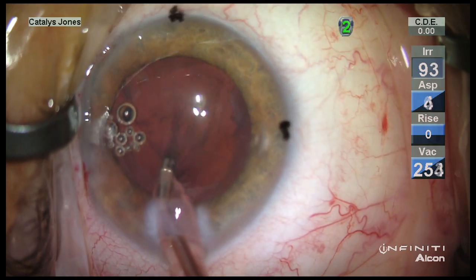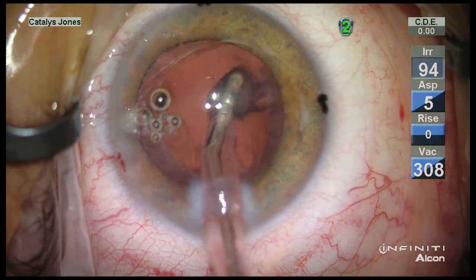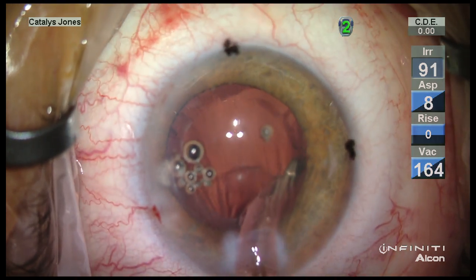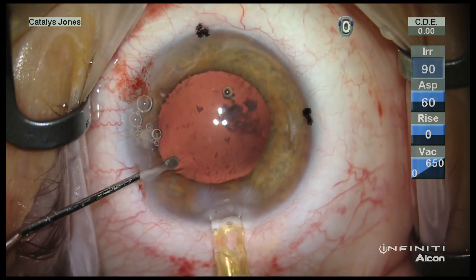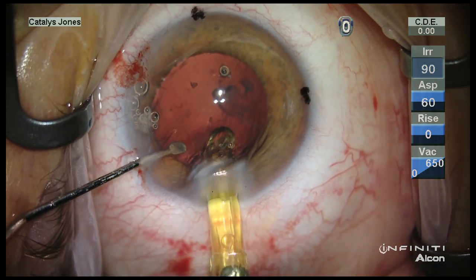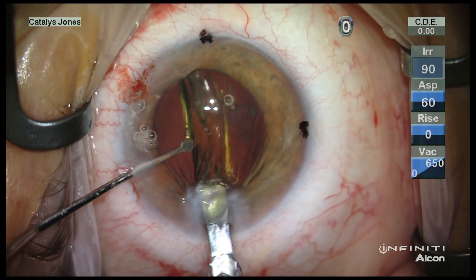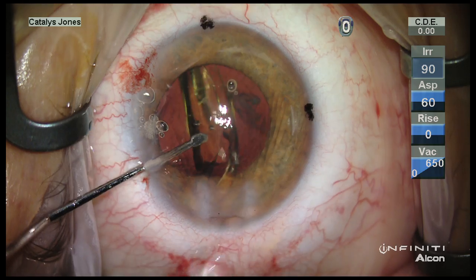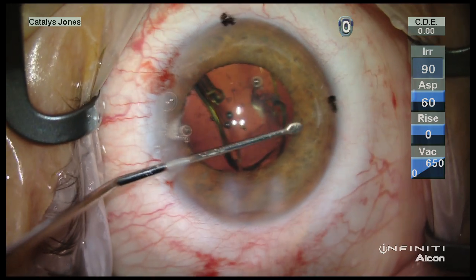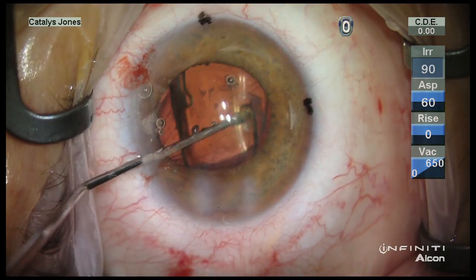Cortical removal is fairly routine and then a single piece acrylic lens is placed into the capsular bag through an unenlarged temporal wound.